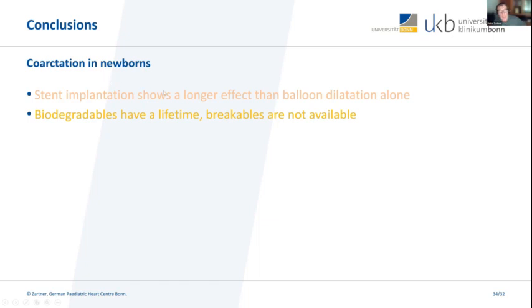Biodegradables have a lifetime. Breakables are not available at this time.